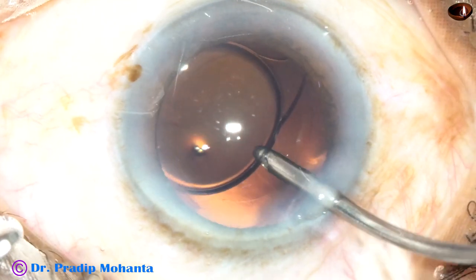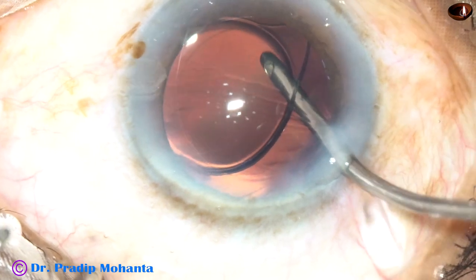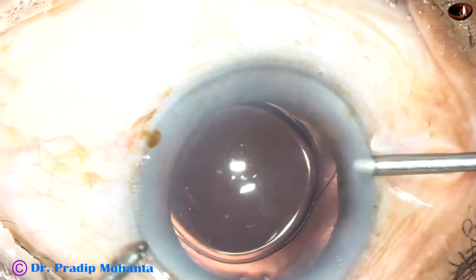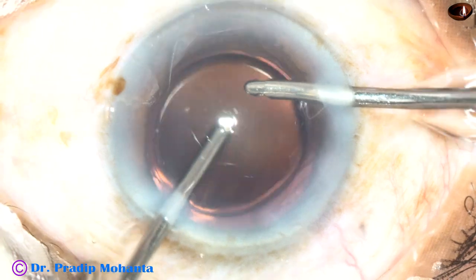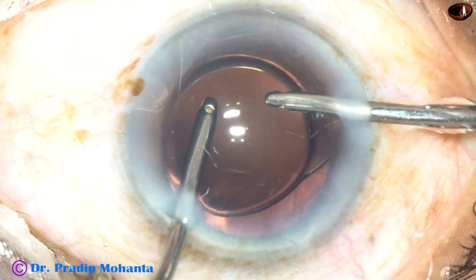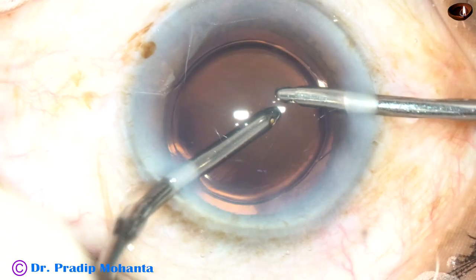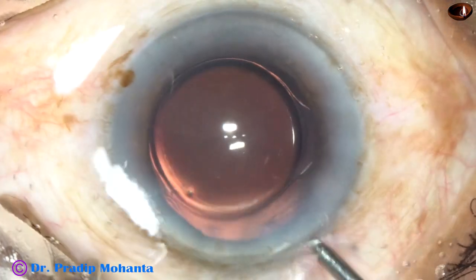The irrigating probe has gone behind the IOL, irrigating the capsular bag and removing the visco from the capsular bag. Irrigation and aspiration is then used together and all the viscoelastic substance comes out. This has been a thorough cleaning of visco.